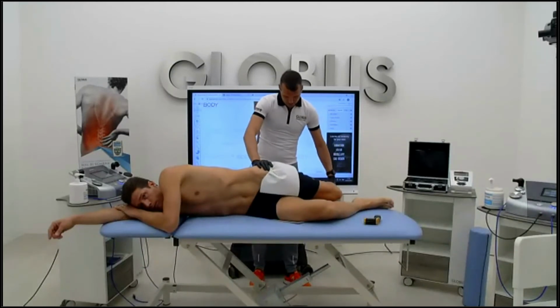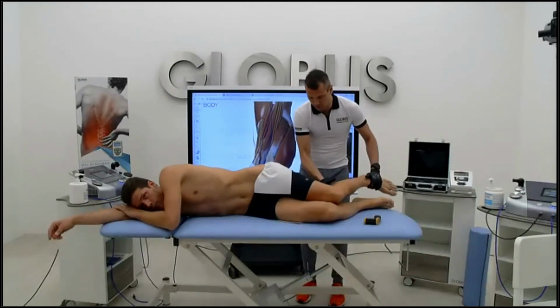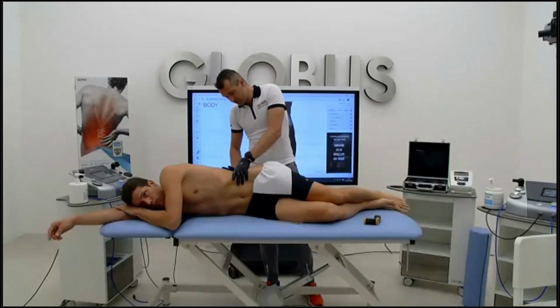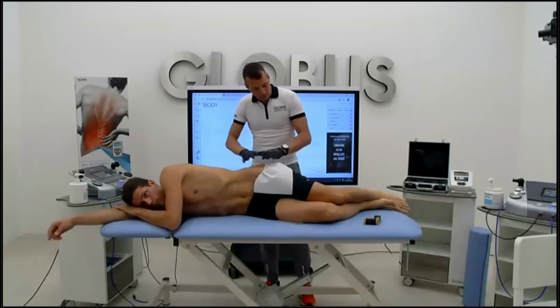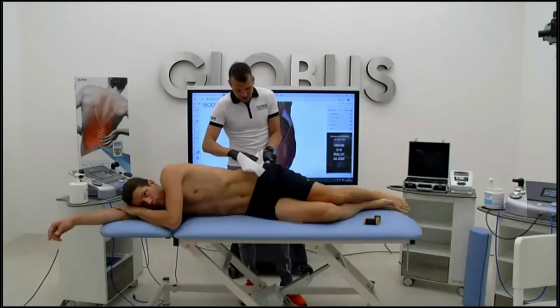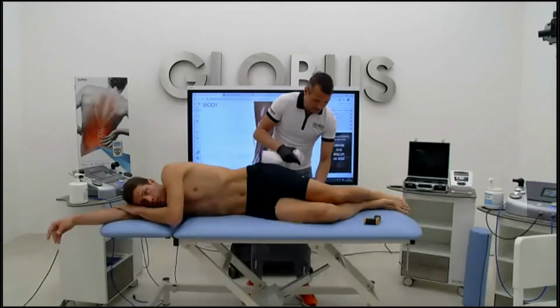All right, so in a few seconds, I try to solve the problem here. Actually, we need to treat also the lumbar part, and we need to go down the fascia lata. Just have a look how to treat the fascia lata with another edge of the tool. So I'm going back to this position.